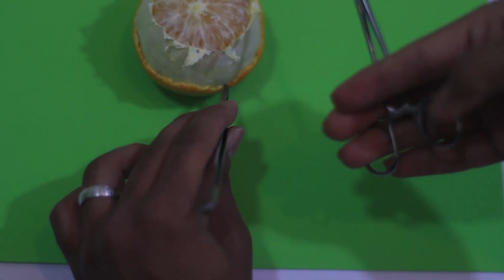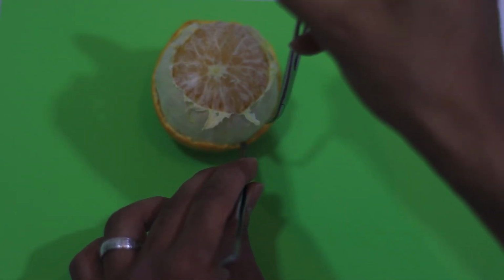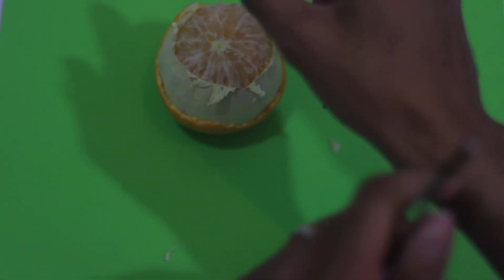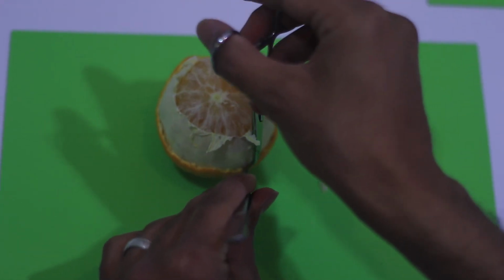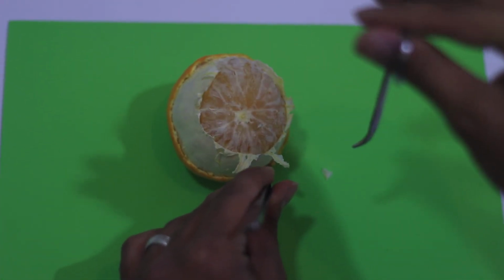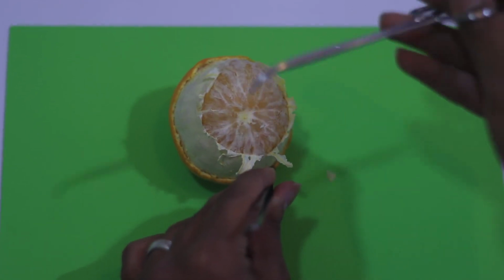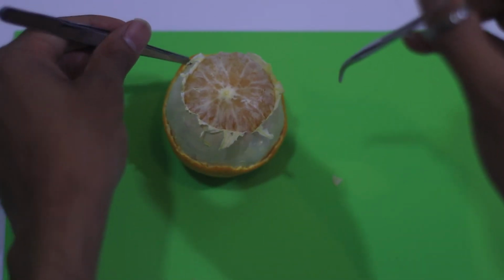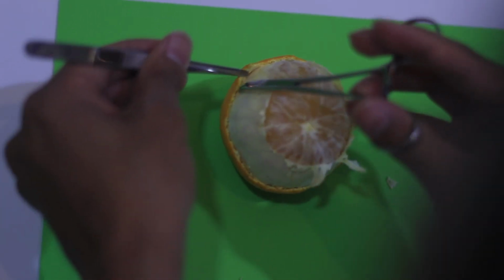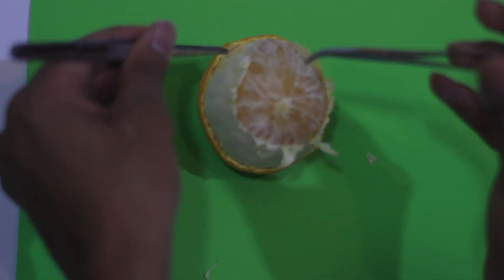So what we will do, actually, we'll rotate it like this, so we can dissect with your wrist and the forearm on the same plane, so you can dissect easier for you. And sometimes even from above, you target the tissue by dissecting on this maneuver. So these are examples.